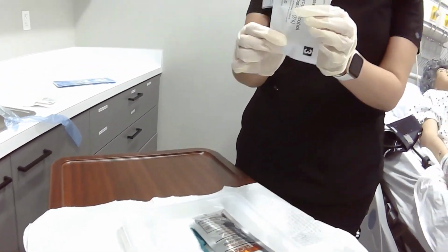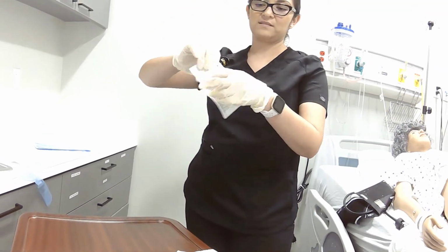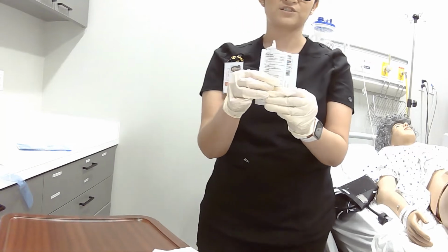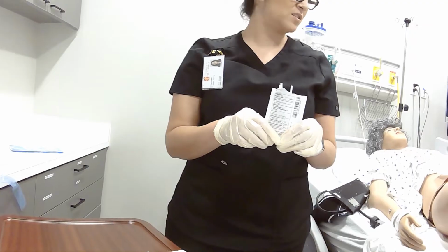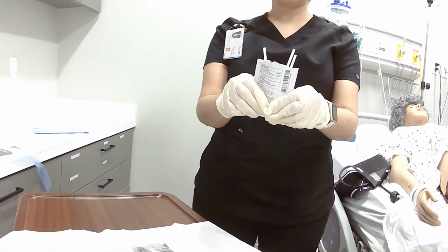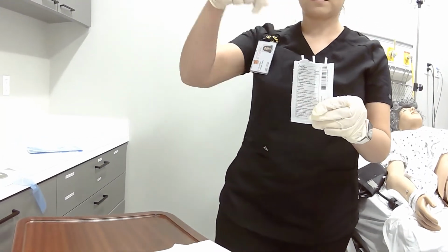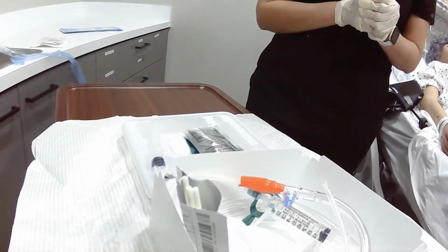So what we'll do is we're going to open the swab stick package, making sure that I'm stepping away because sometimes the liquid in these can drip all over your sterile field. Anytime your sterile drape gets wet, it is contaminated and you'd have to start over. Okay? So I've opened my swab stick package and I'm separating them so that they're not stuck together when I get ready to use them. And then we'll place them in our kits.